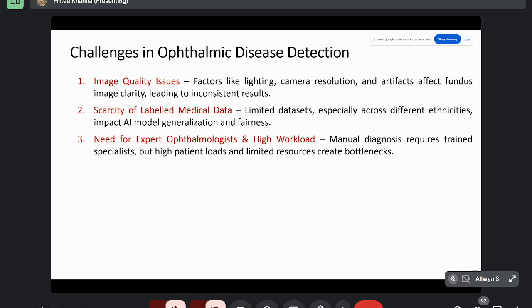The last work of his is based on GAN, right? So generative AI. We have developed a model that generates images, because many times in the data set there are very few images, so they cannot be used to properly train our model. So these days generative AI is there, where data can be generated.